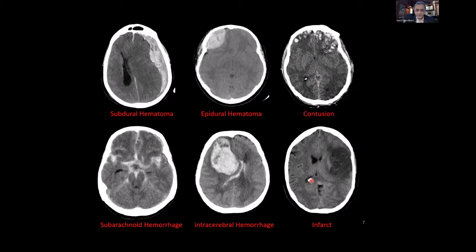Now all these patients would have different symptoms, and if there was no CT scan, it would be very difficult to figure out the symptoms based on this. So a CT scan is worth 100 neurological exams. And if you are really cocky, you can say a CT scan is worth 100 neurologists.